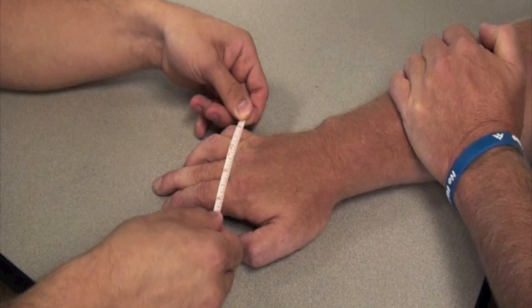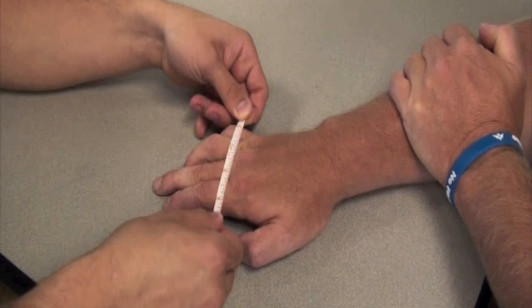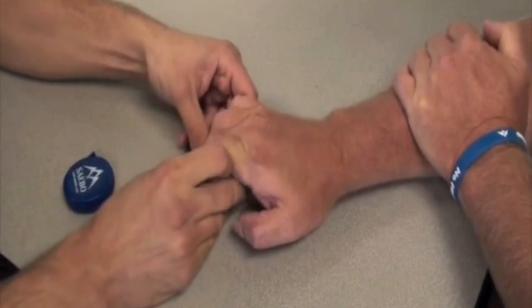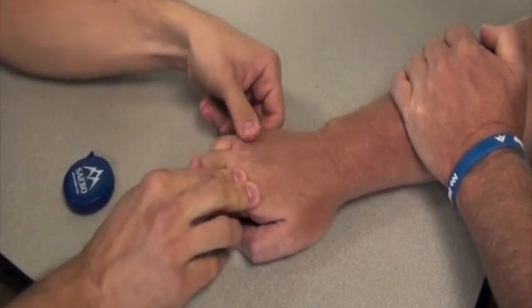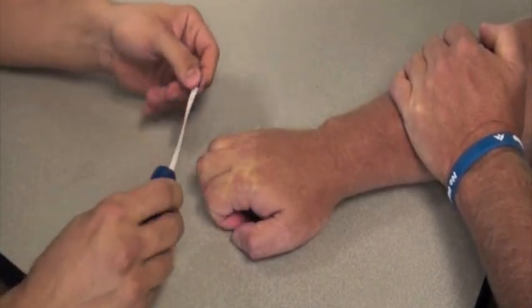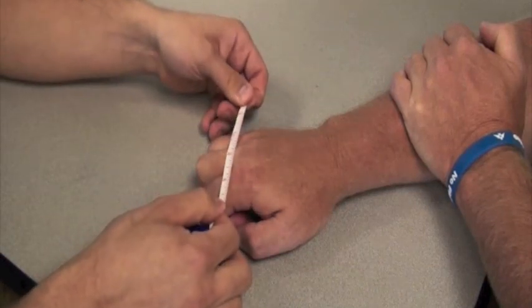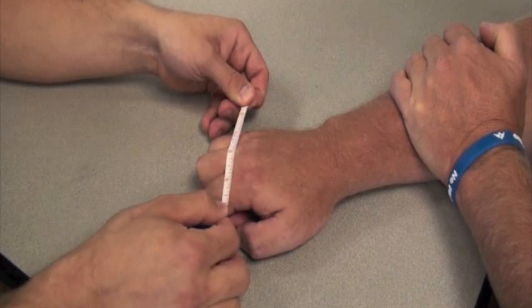If your patient has a lot of tone and soft tissue shortening, feel free to curl the fingers in to get the same measurement — it's not imperative that the fingers are flat. You can also do a measurement as such, but make sure that you don't wrap the tape measure around the edges.